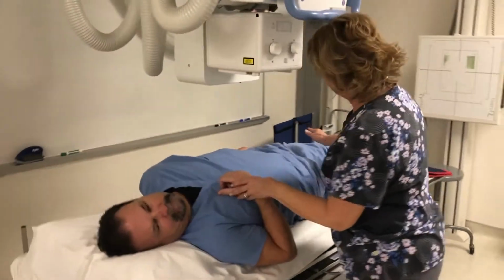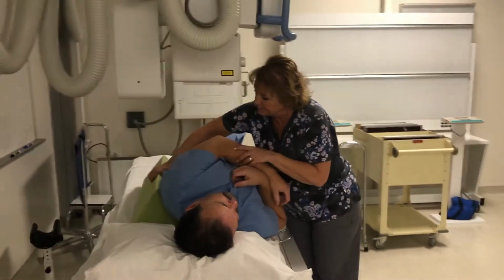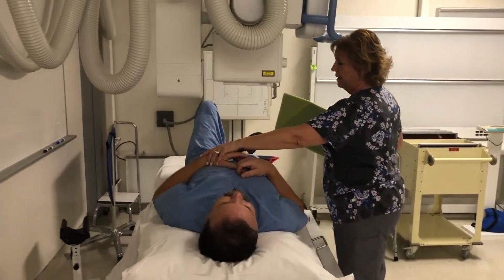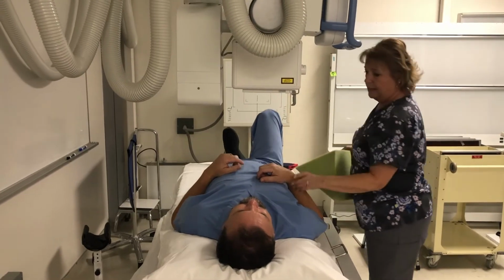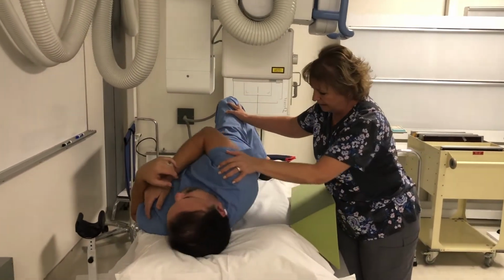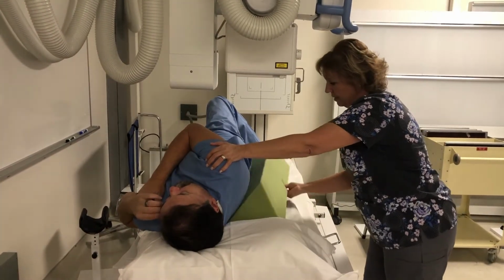All right, so bend your left knee for me again, and we're going to pull this sponge out. Okay, lay back flat on your back. And now I want you to bend your right knee and cross your right arm over your chest, and this time roll away from me. Okay, get on the 45-degree angle.